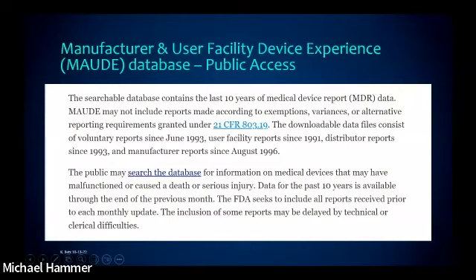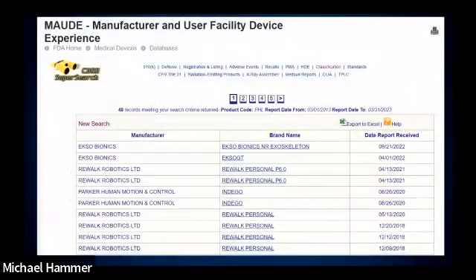And so a lot of folks are looking for, gee, I'm looking at this new device. It's been on the market for 2 years. I have a client that's now asking about it. I go to the MAUDE database. Have there been any problems with this? And it's so easy to search through this information. So it's available across the world. It's a robust data set of gazillions of pieces of information.